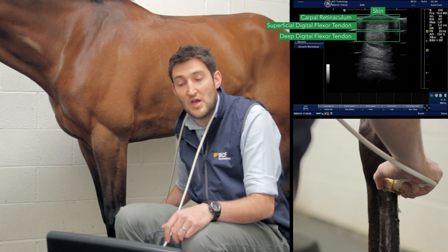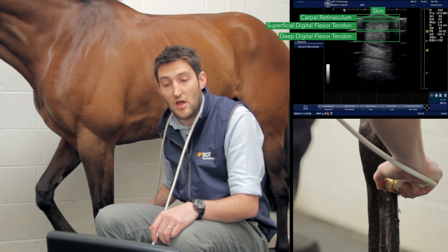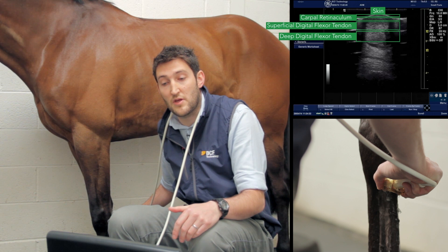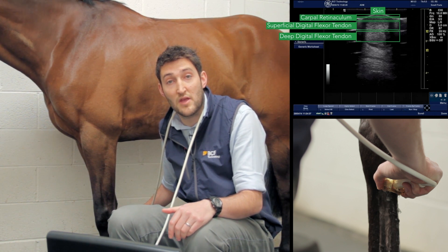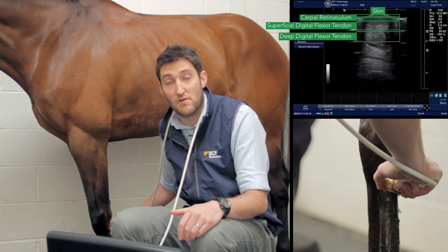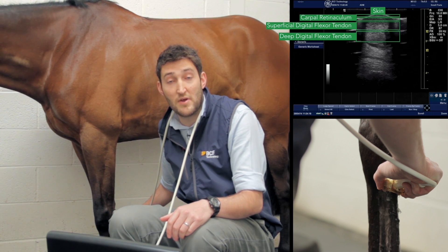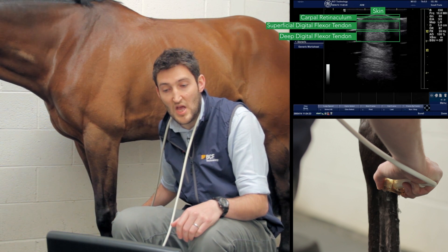It's normal that you can't see the lateral edges of the deep digital flexor tendon and sometimes the superficial digital flexor tendon either. We can address this by moving the probe slightly laterally or medially to catch those edges, fully assessing the shape and integrity of the structures. For surface area measurements, we just need the bulk of those structures in shot.